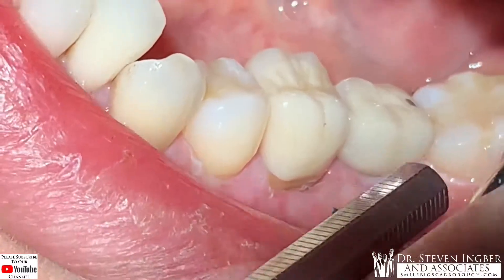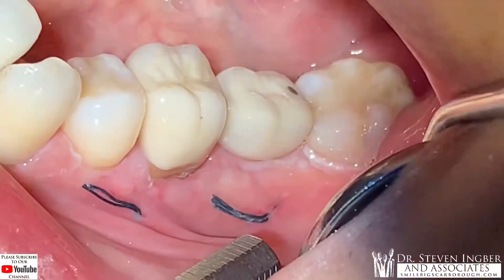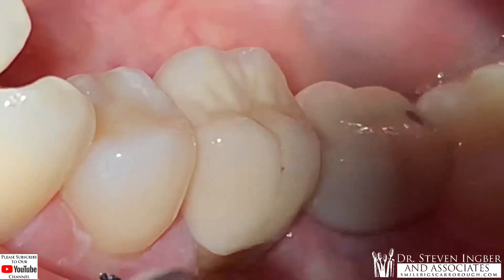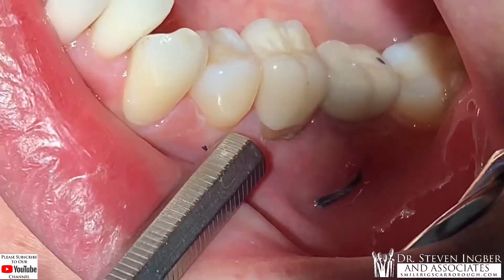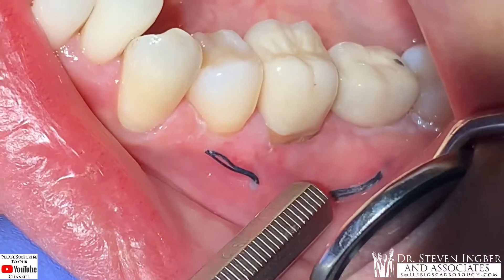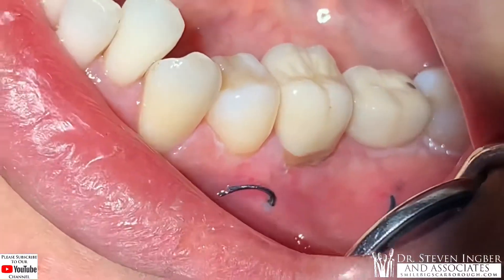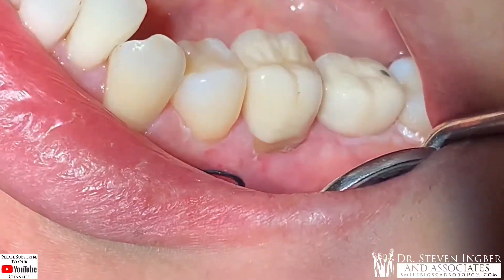Here's an implant too — just to digress for a quick moment. This is an implant I did a few years ago, see this little guy here? So this is the cut line: here was the vertical, across here, and a vertical here. I opened it up and there was a defect in the bone between the roots. I went in there and smoothed it out, doing a shaping in there with a special set of burrs.